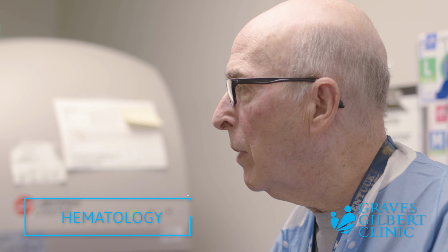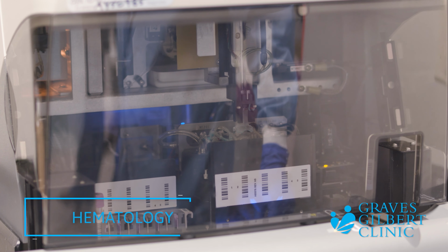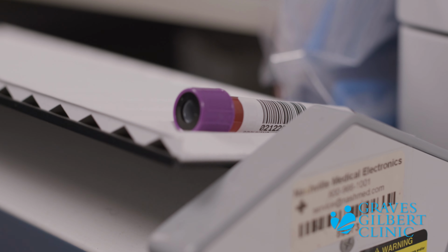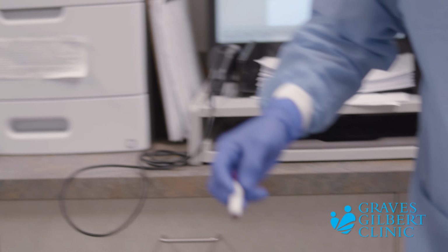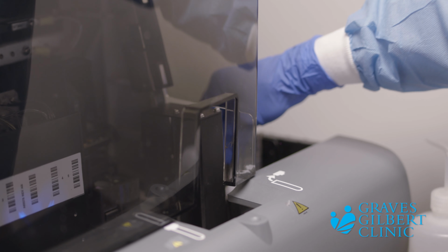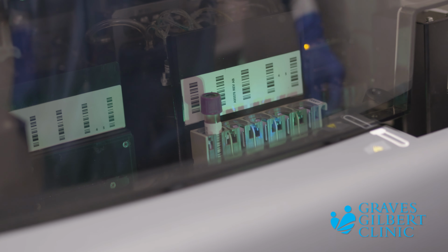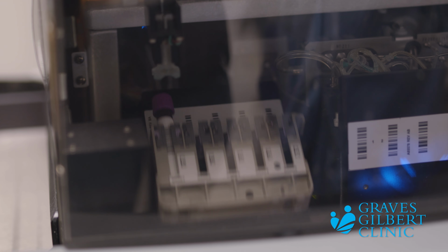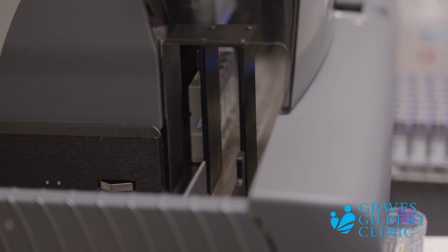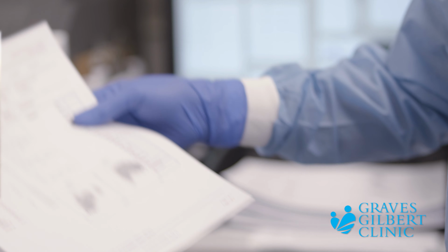This is the hematology department. This instrument is DXH600 made by Beckman Coulter. We run a complete blood count, a CBC. We load the sample into this cassette, barcode, which has the patient's name, gender, and age. Put it on the instrument. The instrument loads it on. The instrument mixes the sample 11 times and performs the count. The tube comes out over here when the sample is complete, and the results are printed on a printer of the complete blood count.